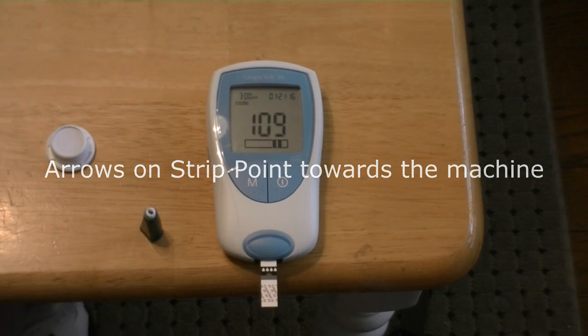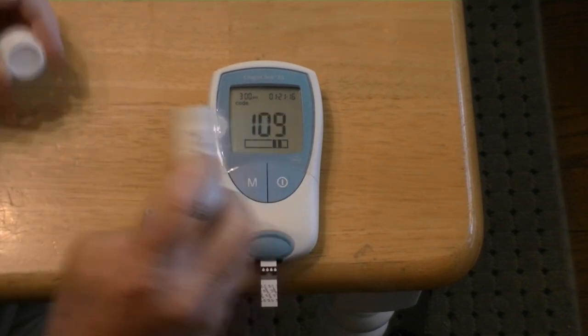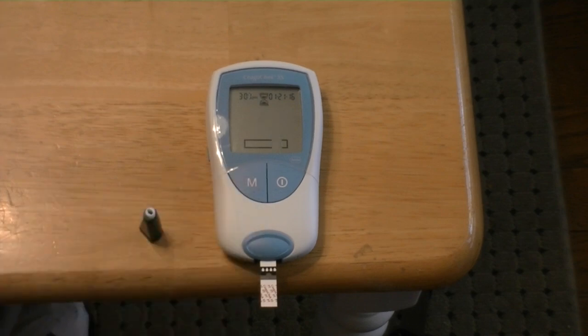It will beep at you and it should give you a number. That number should match that number on the strip, which it does, so I put the right strip in the machine. Then we hit the M button and it's going to count itself down — anywhere from 25 to 35 seconds. Depending on battery level, temperature — all those things affect how quickly this machine works.